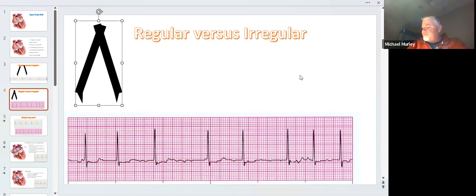And I had a physician years ago that taught me that a tachydysrhythmia is AFib until proven otherwise. And I'll be darned if he isn't right, because the hardest ones I think to read are going to be when you're trying to determine if a rhythm is VTAC versus, say, AFib with aberrancy. And we'll talk about that, a little bit more advanced stuff, or VTAC versus a left bundle branch block, those wide complex delayed conduction in the ventricles. So those can be very difficult.